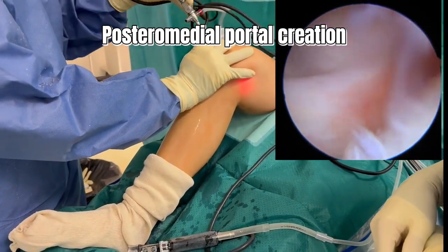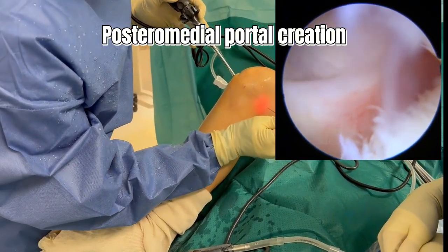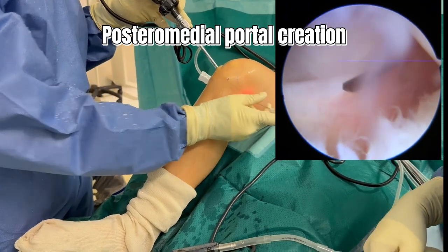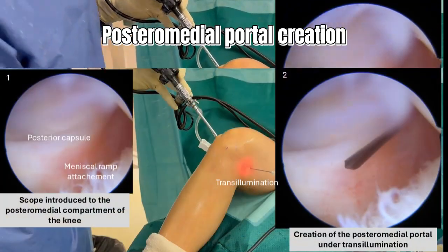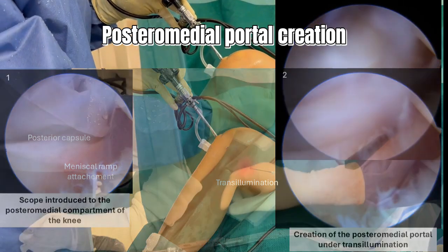Under transillumination guidance, a posteromedial portal is safely established using a spinal needle, ensuring adequate distance from the medial femoral condyle to prevent injury to the saphenous nerve and vein.